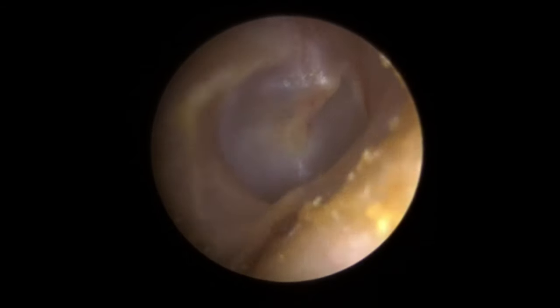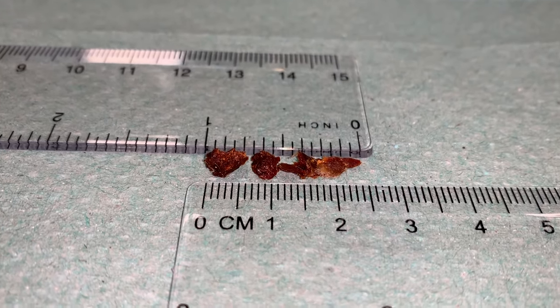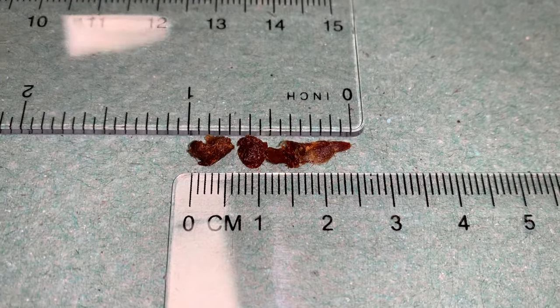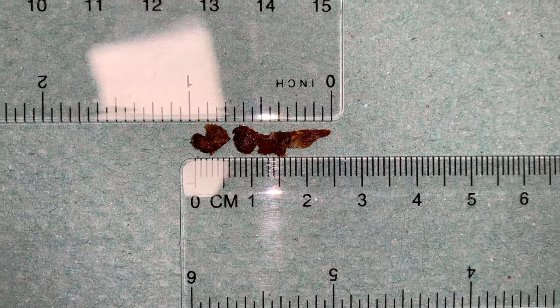If you're looking for an opportune time to go and get yourself a cup of tea or coffee, before the next one would probably be a good idea — because the next one goes on a little bit longer. It's a bit more of an intriguing one. I now have dual rulers — I've got two and a half centimetres and an inch. So I can tell it at exactly the same time. I just thought this might be the easier way rather than recording two videos with the same bit of wax — one of you guys' ideas to do that.